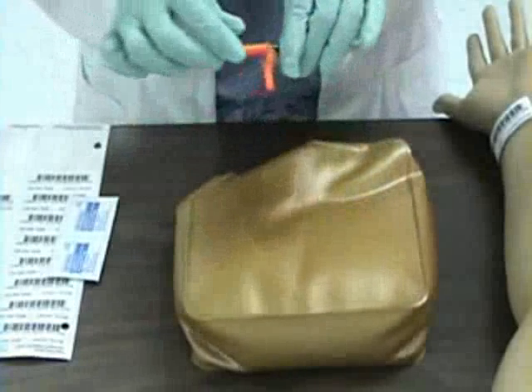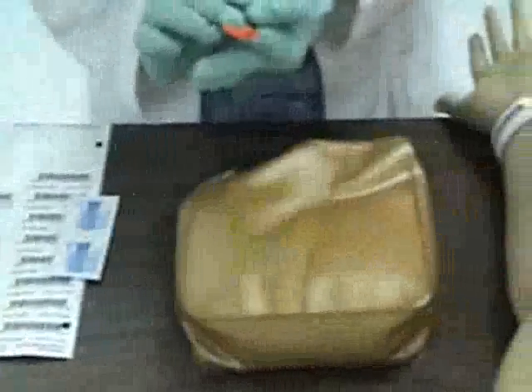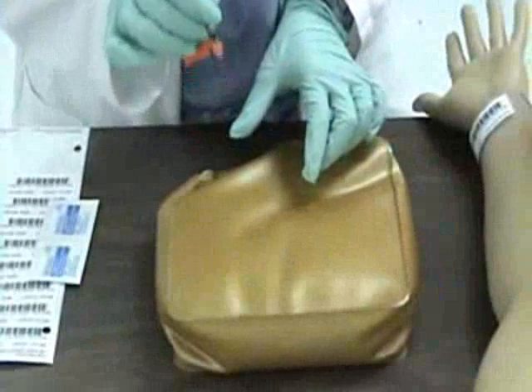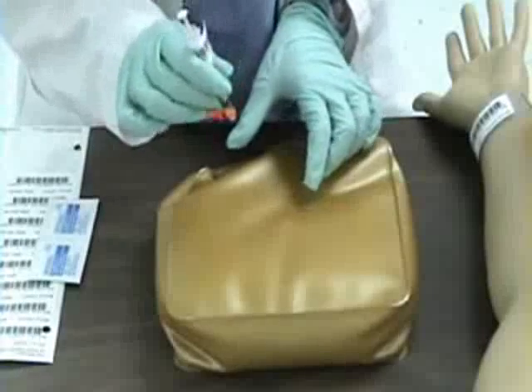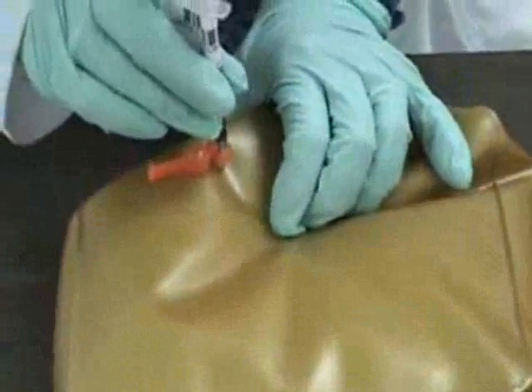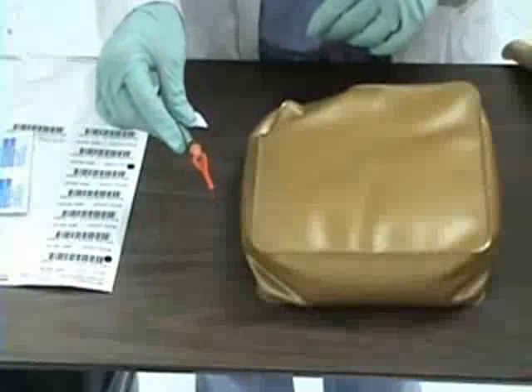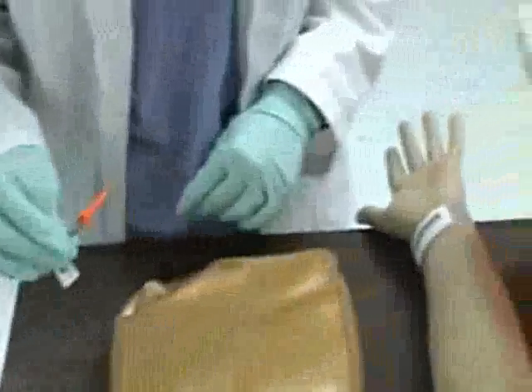I will remove my cap and discard in the trash. I'm going to dart the needle quickly as it will decrease pain to the patient. I'm injecting the medication, then releasing. I will engage the safety device and dispose in the sharps container.